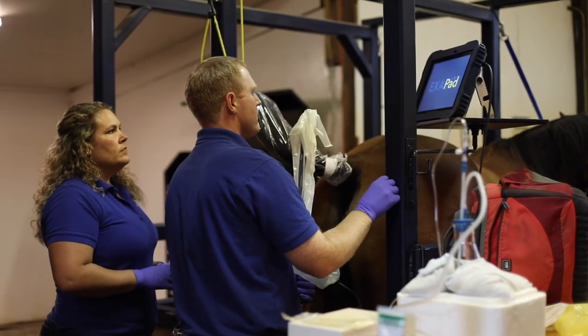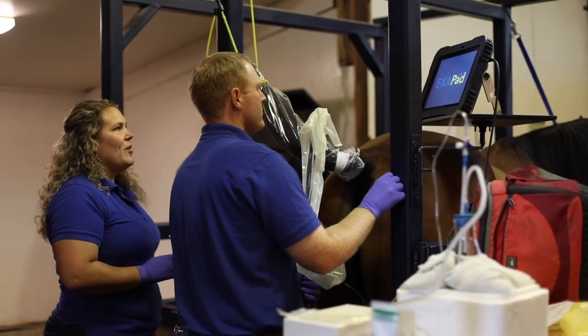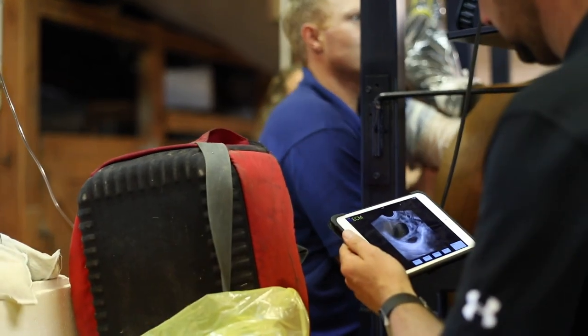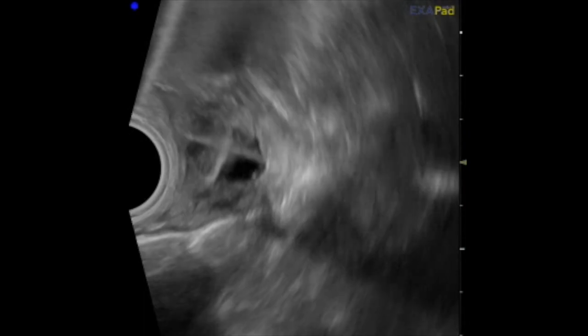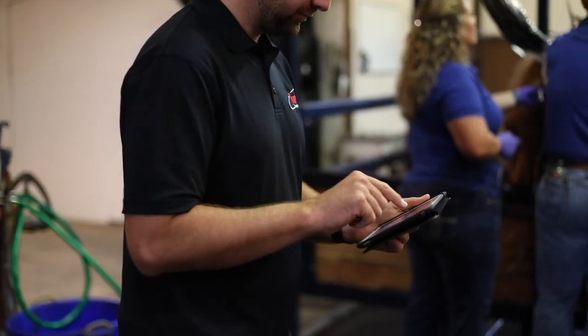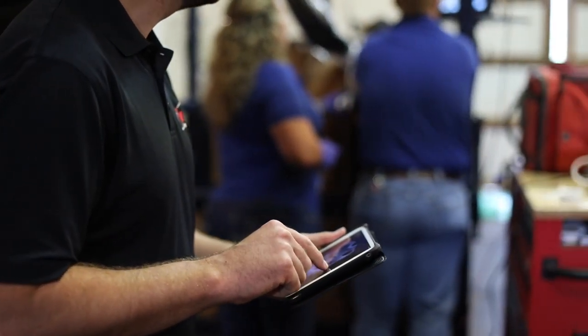For oocyte aspiration I've elected to use the EXAPad mostly because it's a simple standalone system. It's easy to put together, has one probe that's very easy to assemble and to utilize. It gives us a great image for follicular aspiration and our recovery rate has been very good since switching to this platform.